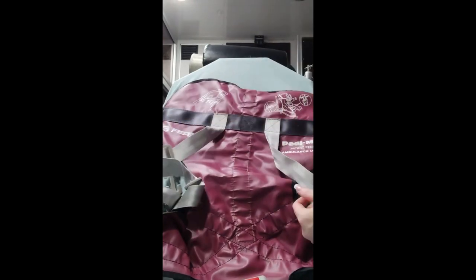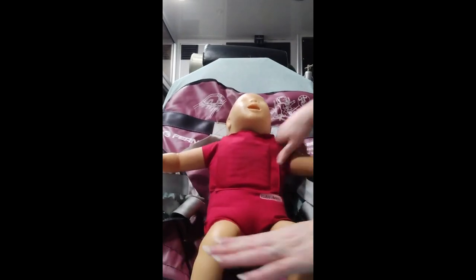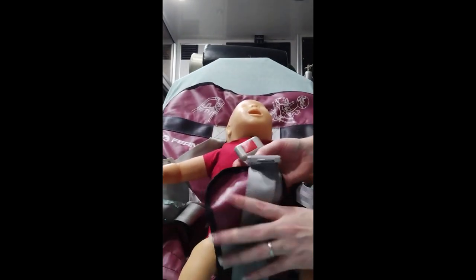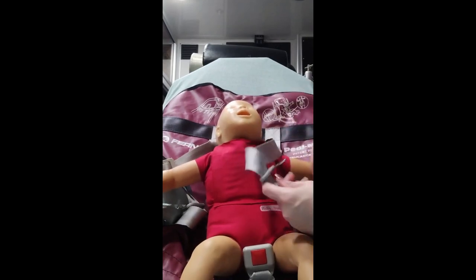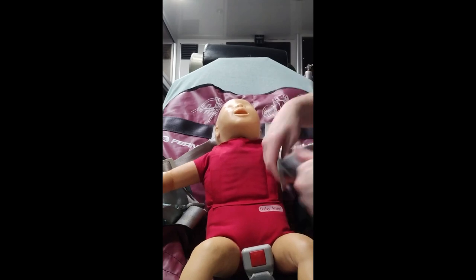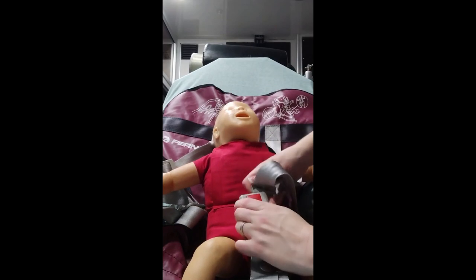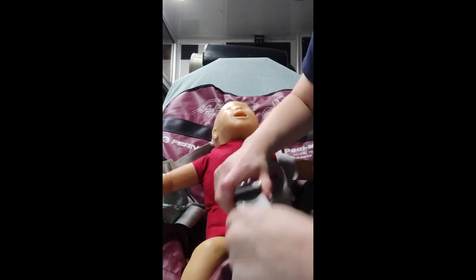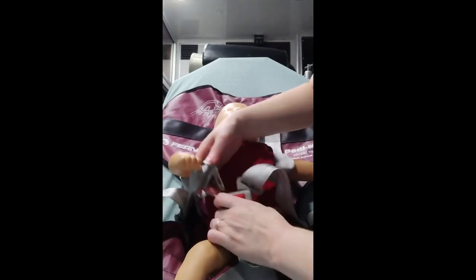Now we're going to get our baby and put our baby in here. It will fit on there just like a regular car seat. This little doll isn't quite the right size but you get the idea.